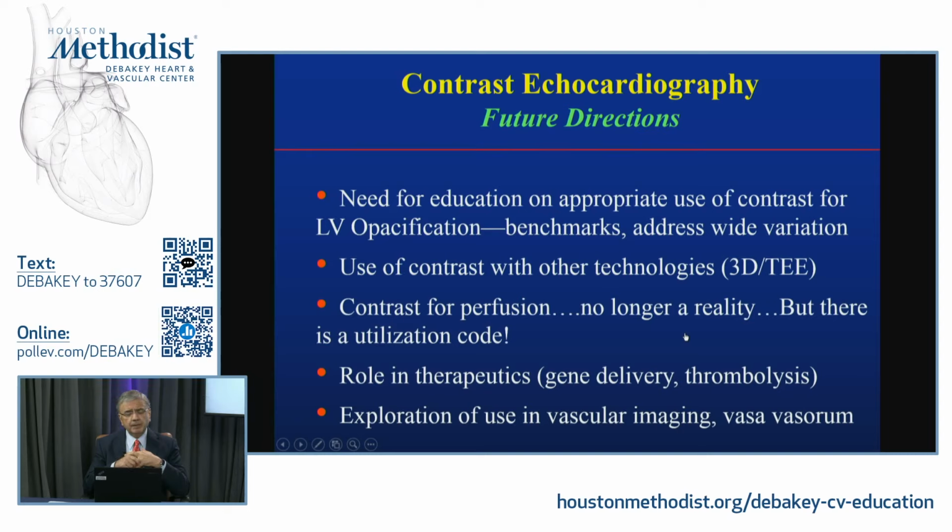So I'm confident that most people would use these contrast agents appropriately in the indications that we talked about, which can really enhance the quality of the studies as well as the interpretation, which has important clinical implications for therapeutics and further diagnostics and many other things. And remember, echo, irrespective of what you do, is the first-line diagnostic modality for us to treat and take care of patients with cardiac disease.